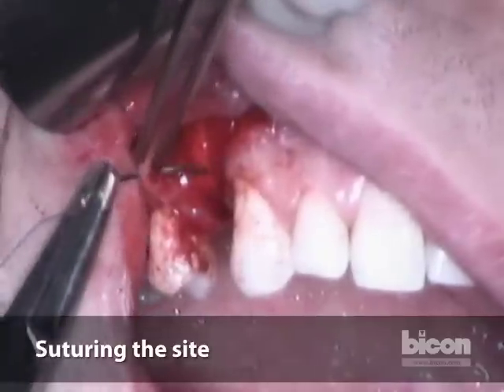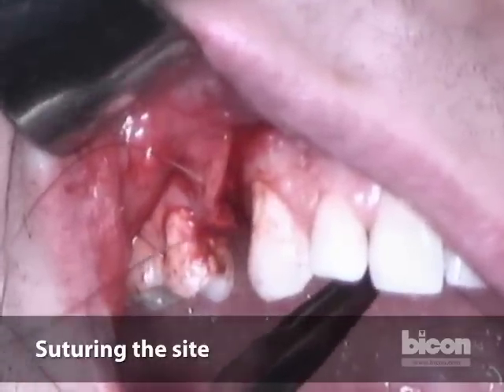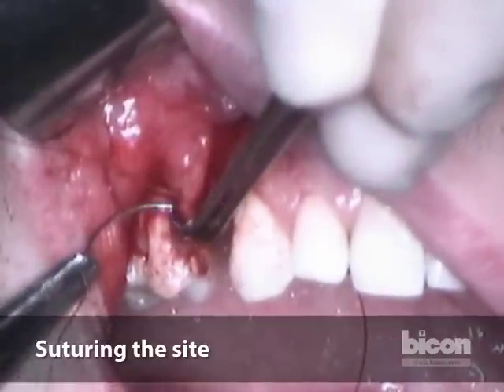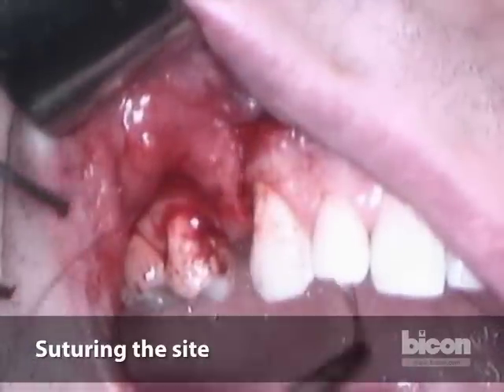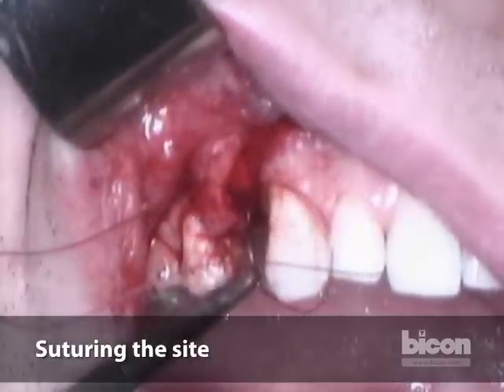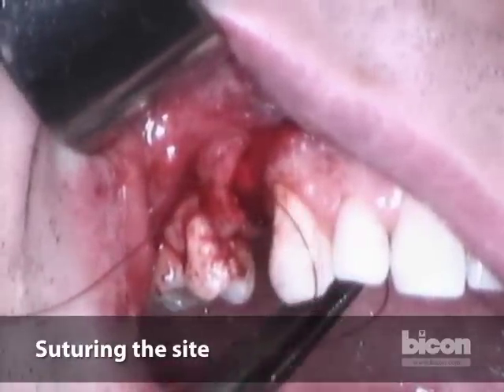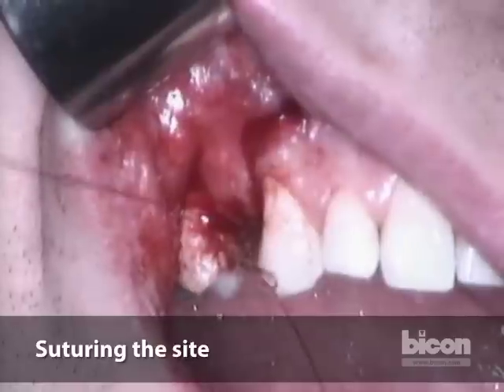You don't want to take your bite with the suture too far at the very tip — it will choke it. So we take it slightly below where it starts to widen up. And there we are. We will use a figure-of-eight suture to strap it down in the center.